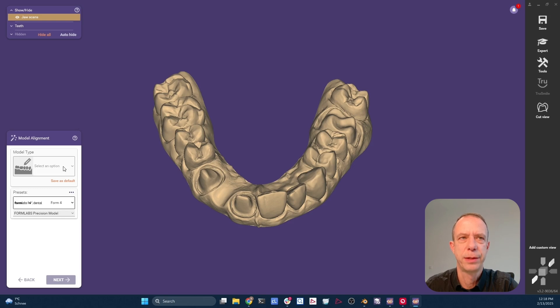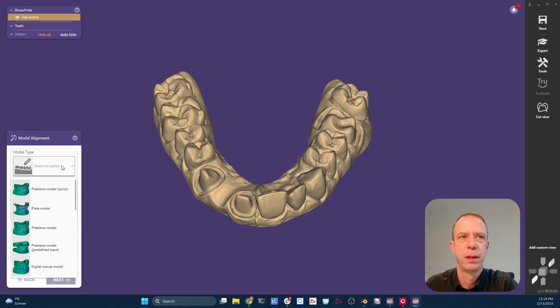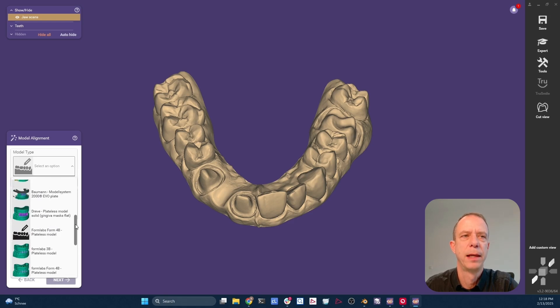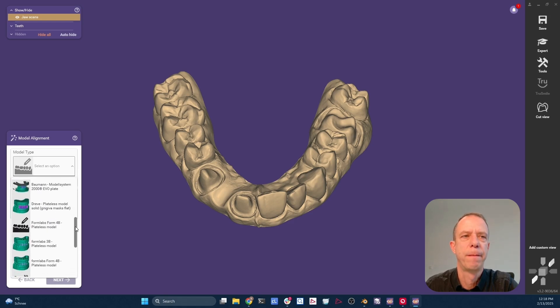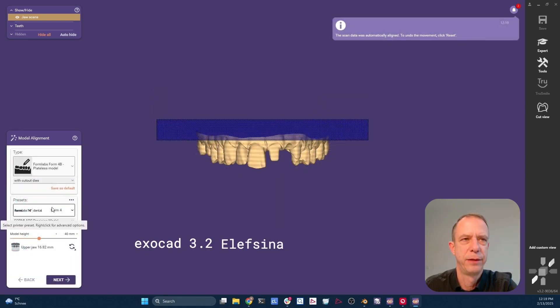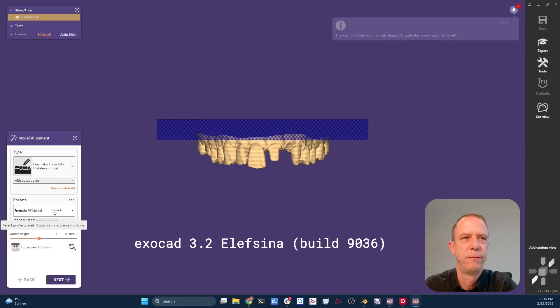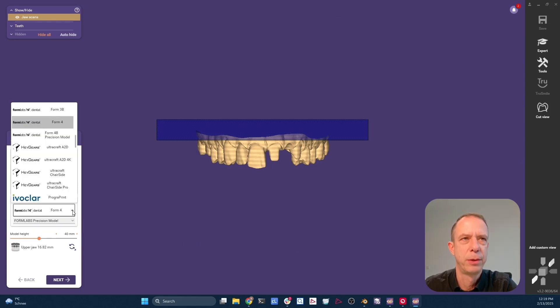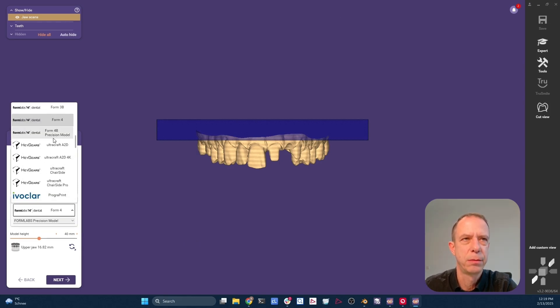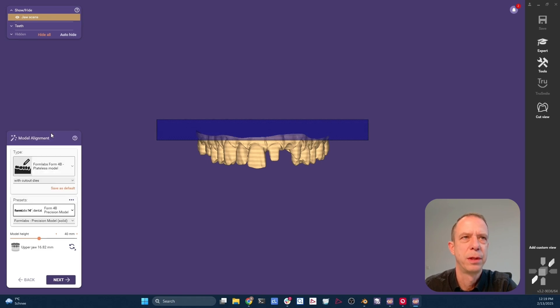And the first thing we're going to set up is telling ExoCAD what to use. So let me click on this select option and scroll down. ExoCAD now comes with a preset for the Form 4B. That's not the one we're going to use. The one that comes with our library that you installed if you followed the second episode is called Form 4B Precision Model. So these are the two choices.